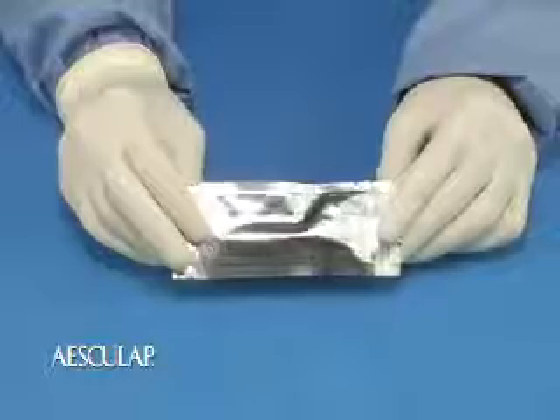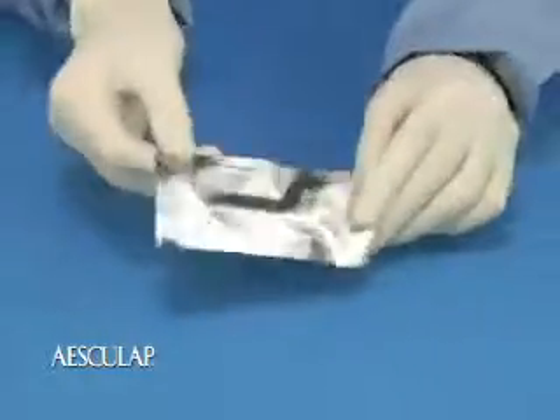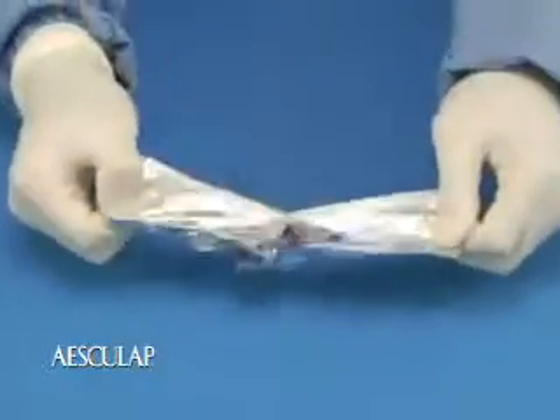Histacryl is supplied in foil peel packets, which are common with other sterile medical products like surgical sutures. To open, simply pull apart the ends of the foil pouch to expose the sterile ampule.